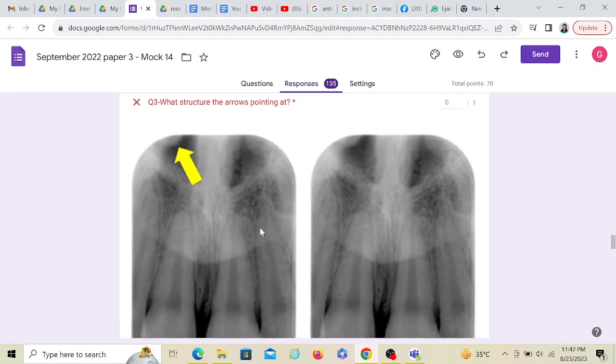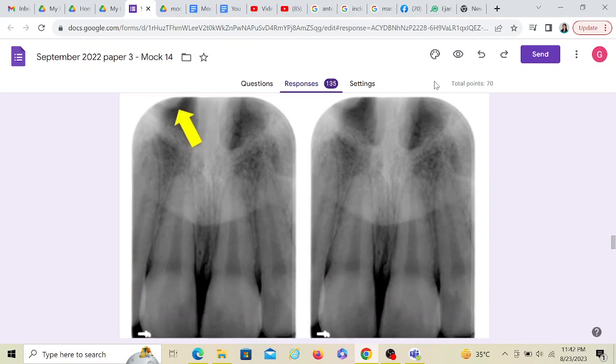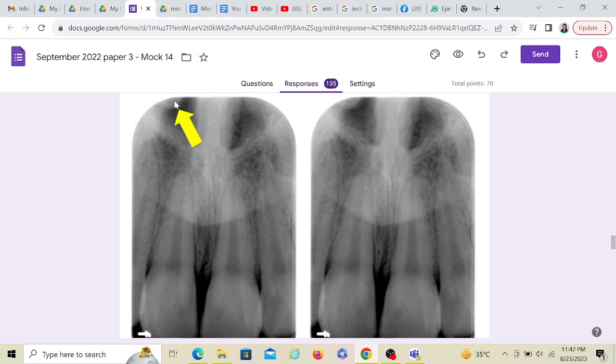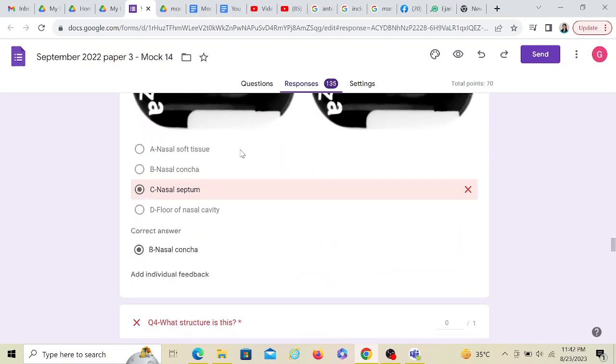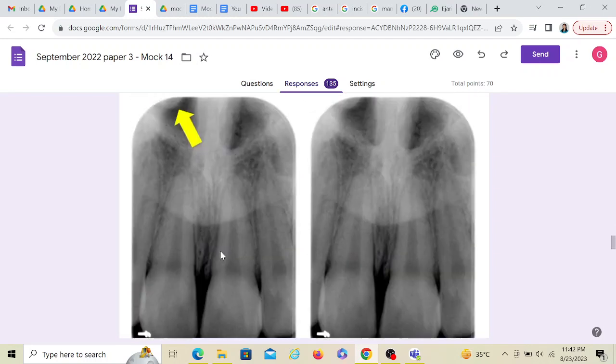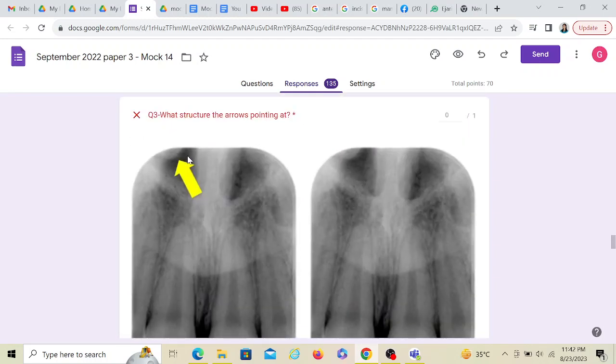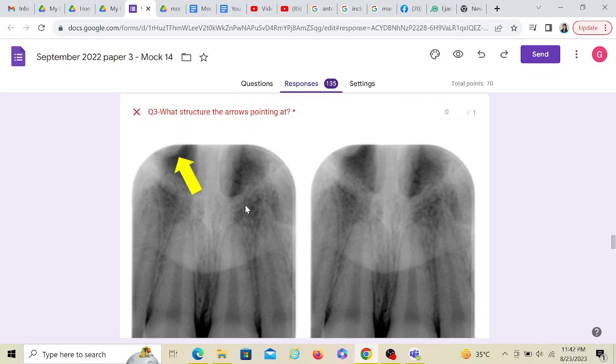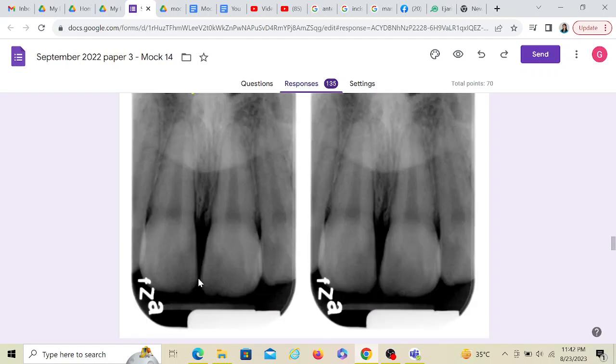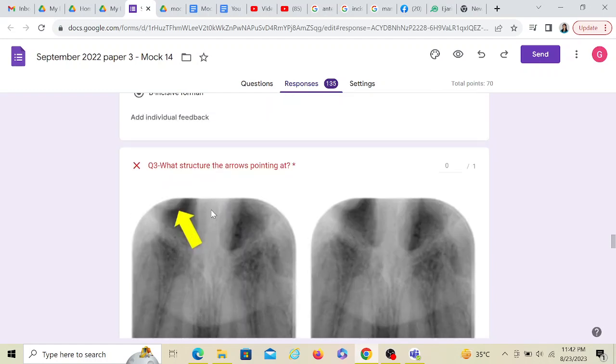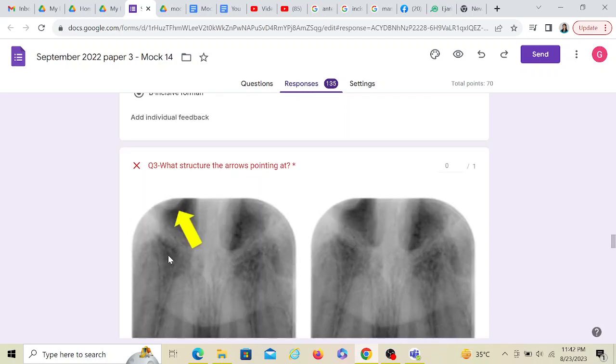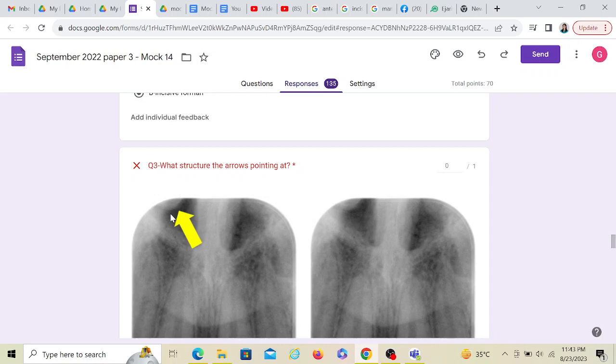What structure are the arrows pointing at? This is the same radiograph here, and this is the arrow out here. Again, this is a periapical. There are two laterals, there are two centrals. We know this is an incisive foramen, this is the anterior nasal spine. What is this? Because this is anterior nasal spine, this cannot be anterior nasal spine, correct? This is a nasal concha. Nasal soft tissue is an option here, but again, soft tissues would be the nose that would not appear on the radiograph. Nasal concha is the right answer. Septum is a radiopaque structure and that too in the center, so that is not the right option.